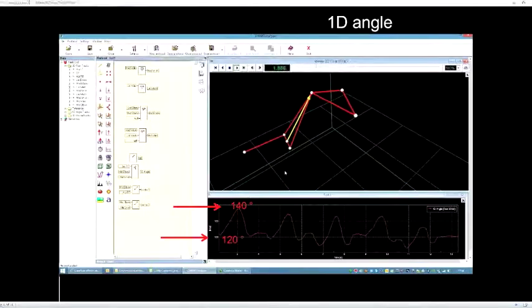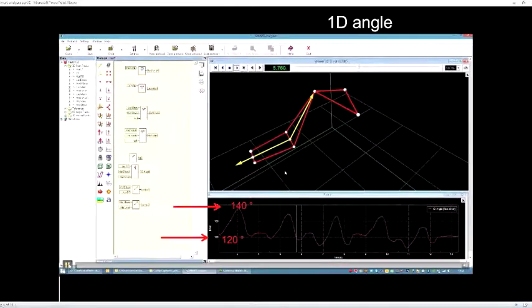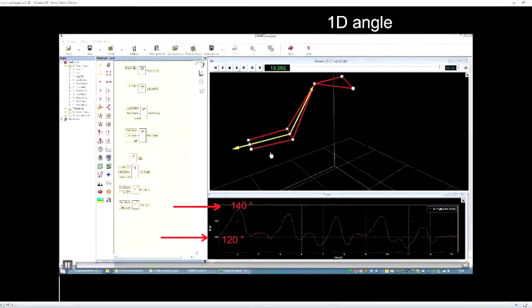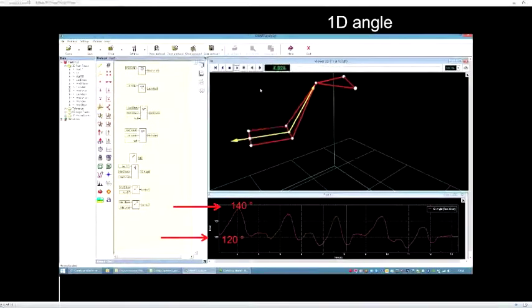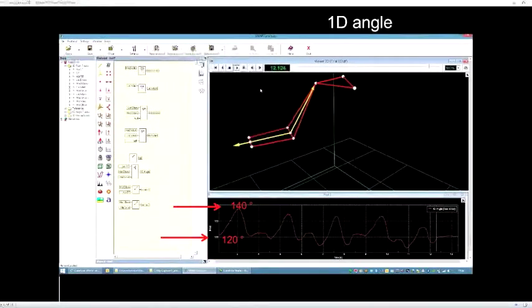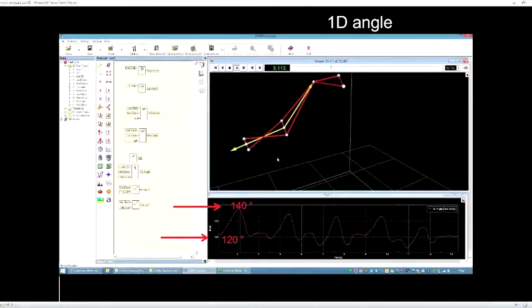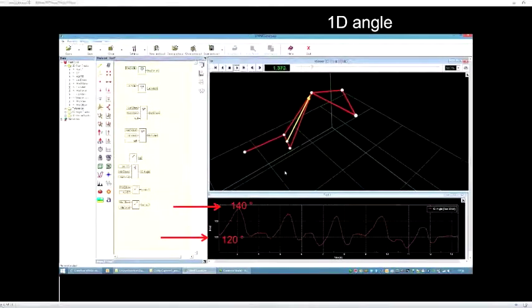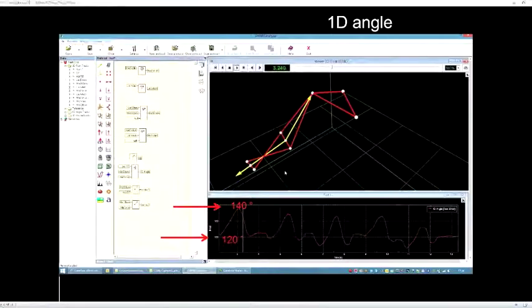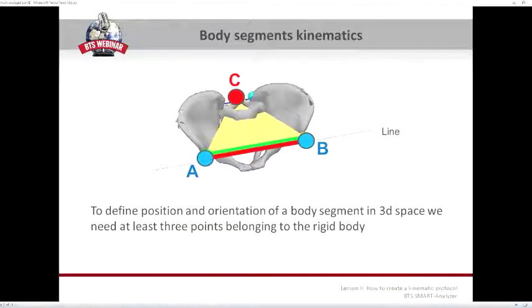In this example, the 1D angle shows just almost 20 degrees peak-to-peak, but this is not correct because the range of motion of the pronosupination task is much higher. So if you want to measure that type of rotation, you cannot do it by means of a 1D angle defined by just two vectors and three markers. You need to define a 3D reference system — one local to the distal segment and one local to the proximal segment — and then compute the 3D angle between these two segments.